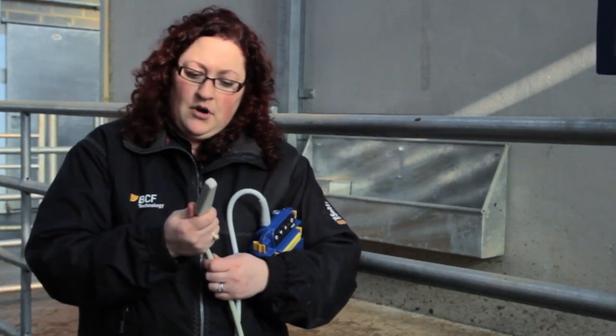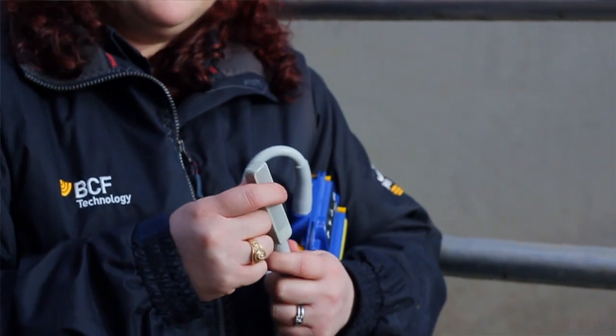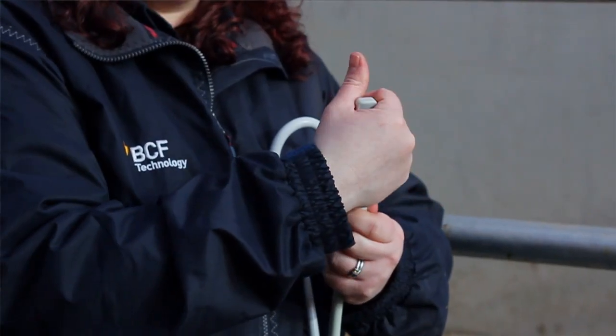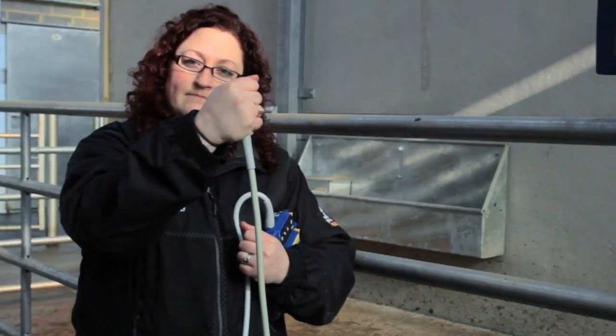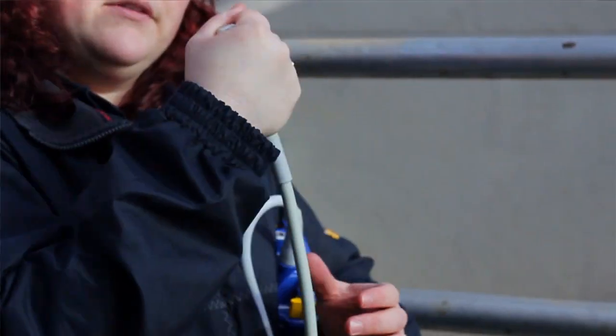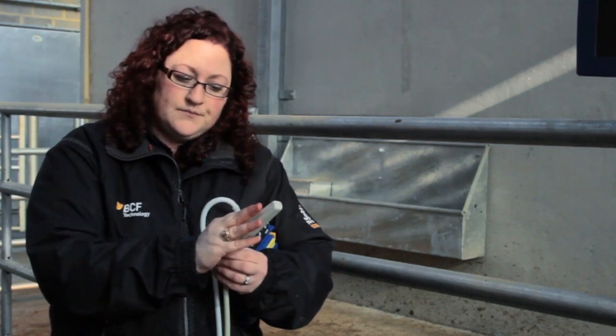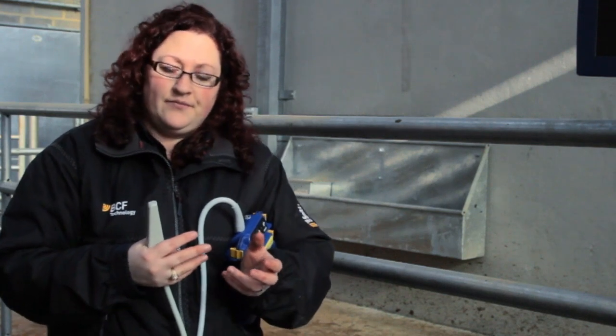Something that you need to remember is that these crystals are a bit sensitive and delicate, and we need to take care of them. So whenever you're holding the probe and it's not inside the cow, it's a good idea to actually cover the face of the probe with your hand to ensure that if you get knocked against a gate, that it won't be damaging the crystals. When you're looking to go inside the cow, the way that you hold the ultrasound probe will enable you to get better or worse pictures.